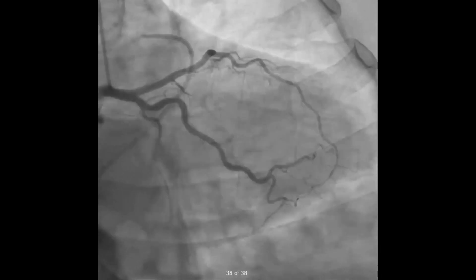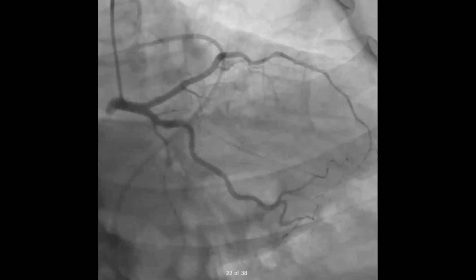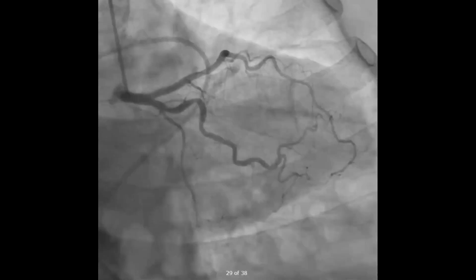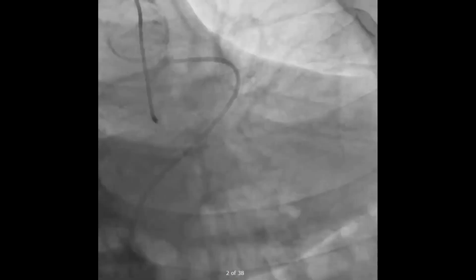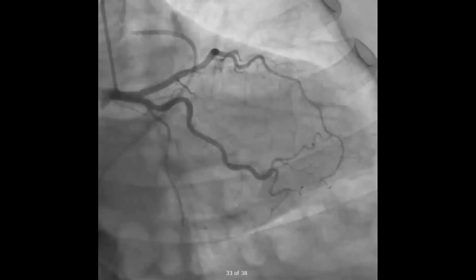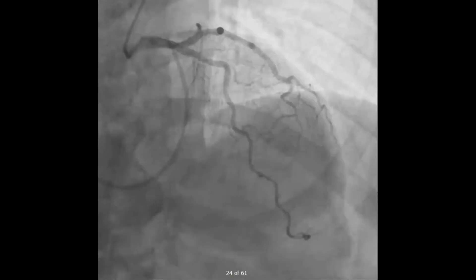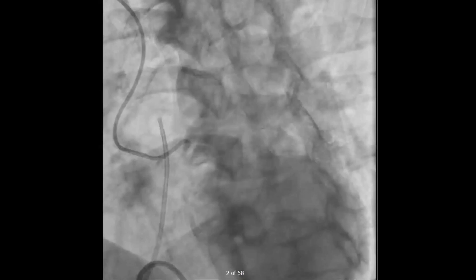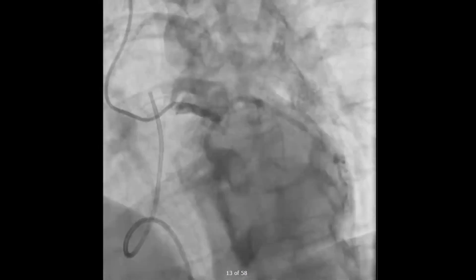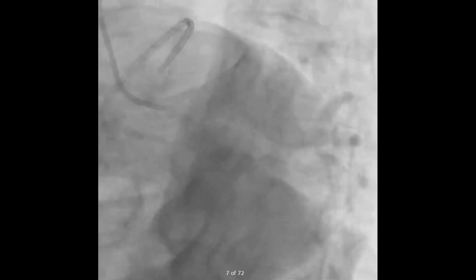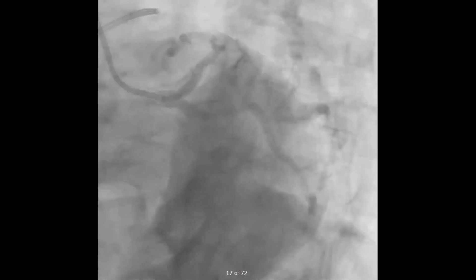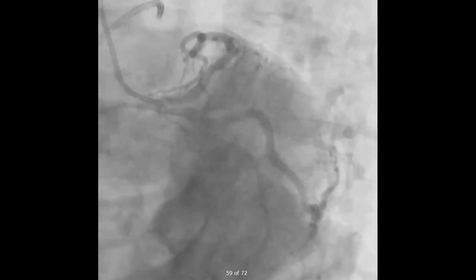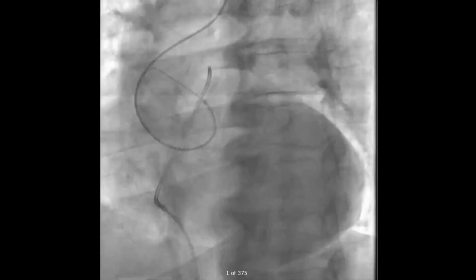We were able to get the left-sided angiogram, as you can see, and it's pretty unremarkable.